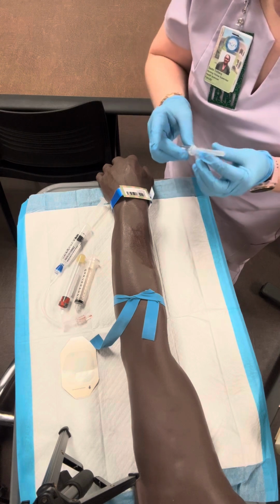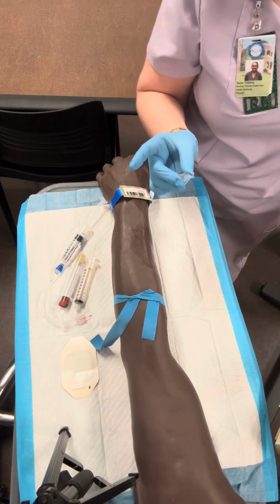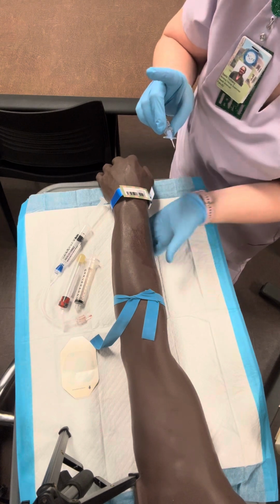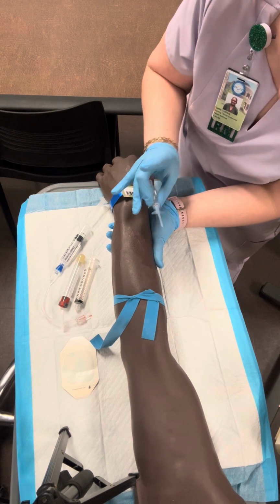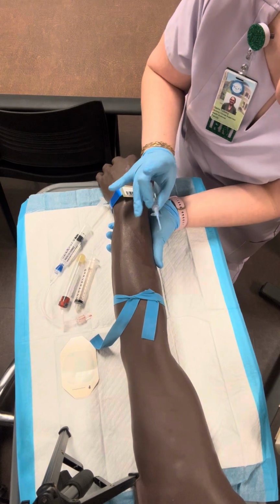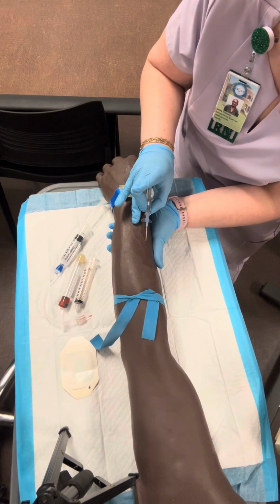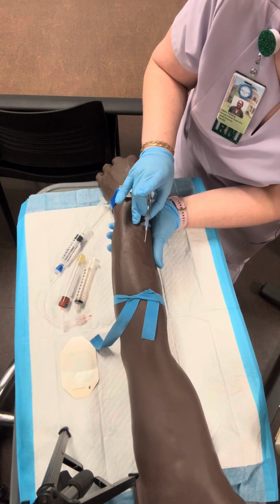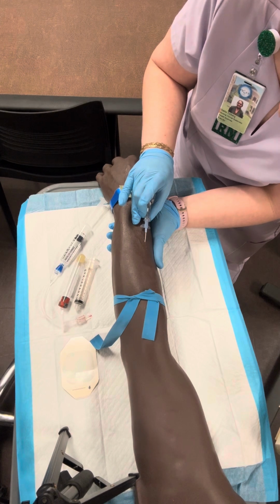I'm going to grab my IV catheter. I'm going to look at it, make sure that it's bevel side up. Okay, this is dry. I'm going to grab with my non-dominant hand, stabilize. I'm going to lay down my ring finger for stabilization. And I'm going to let the patient know: 1, 2, 3, big stick. Enter in at the appropriate angle. I'm going to go in maybe about halfway. I see flash in my chamber.